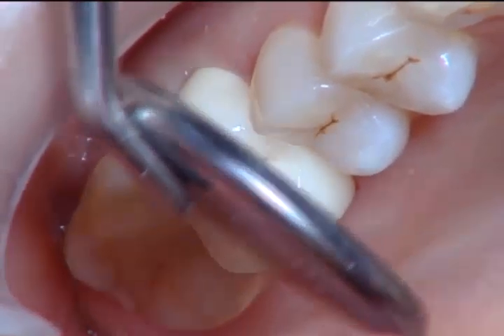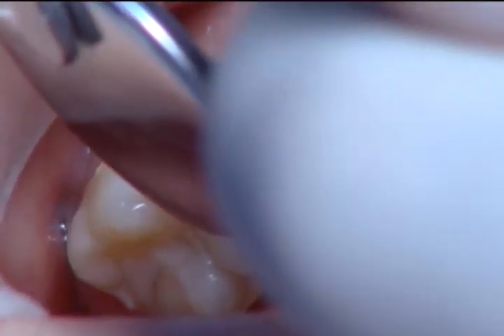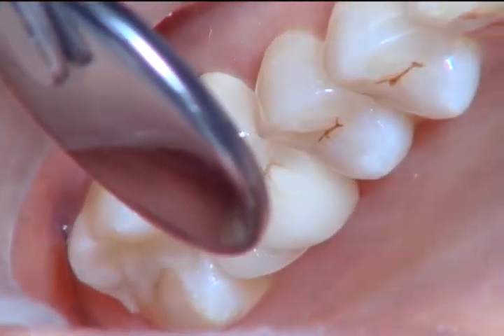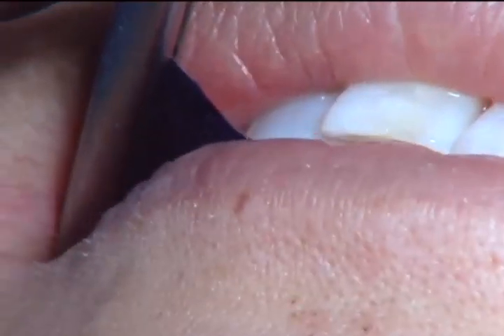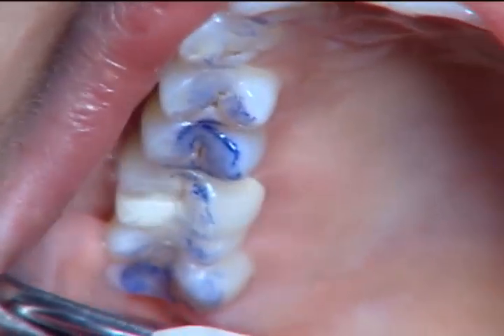We are now trying in the Clinical Zirconia crown. And because the substructure of this crown is zirconia, I know this is going to be high strength. In fact, this is one material I can tell you I've never seen it break when used clinically. That's not to say porcelain could never chip from it. Porcelain can chip from any restoration, but I've never seen the substructure break, and that's pretty impressive for an all-ceramic.